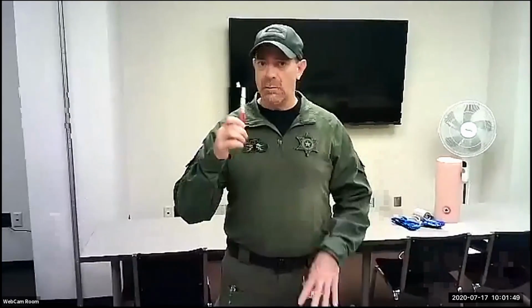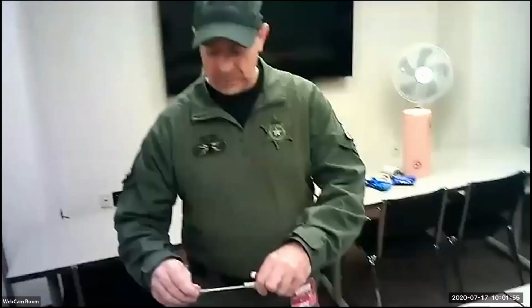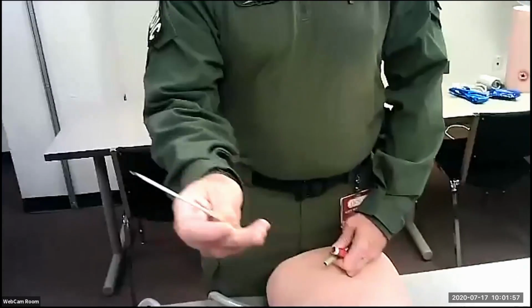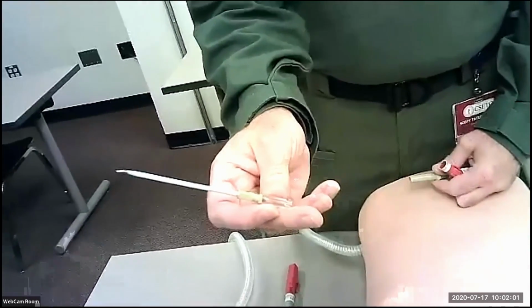And the only way we can fix that is to put a needle in your chest or a chest tube, a really big chest tube. But right off the bat, we're going to needle your chest. You saw in the video how we do that. There's a couple of different things. This one is a 10 gauge, so we call that a big bore needle.